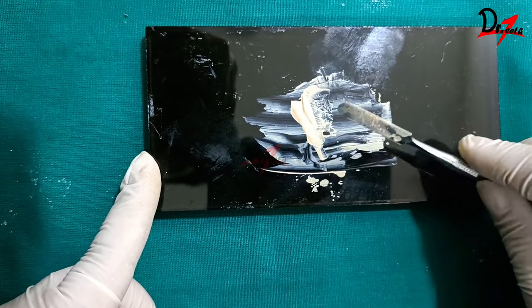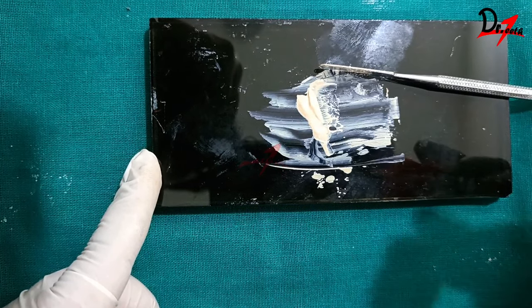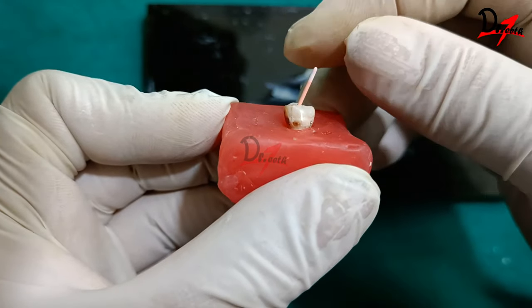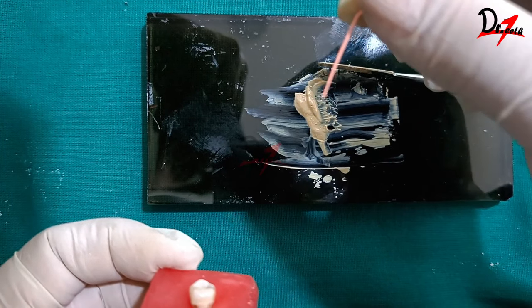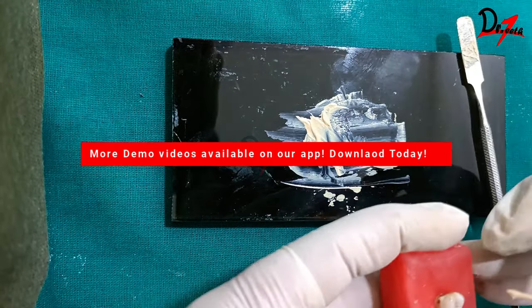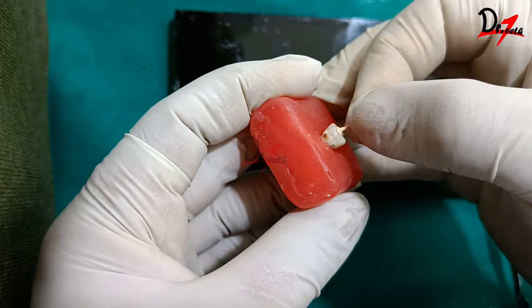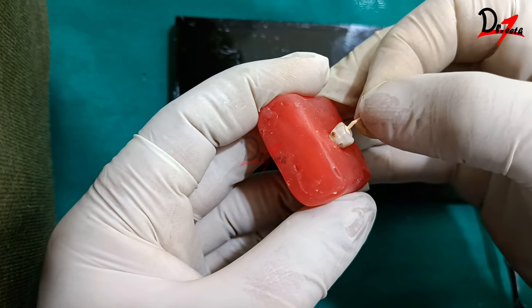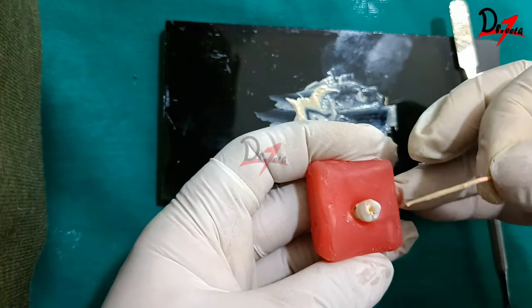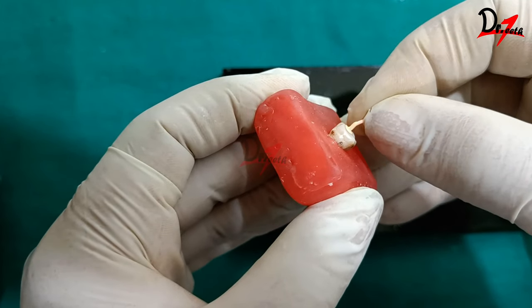We have mixed our endomethazone sealer. Now we coat this sealer onto the canal walls — either using an instrument called a lentulo spiral, or using the master apical GP cone itself. I will use the master apical GP cone to coat the canal. I coat the sealer onto the GP cone and insert it into the canal to coat the canal walls thoroughly.